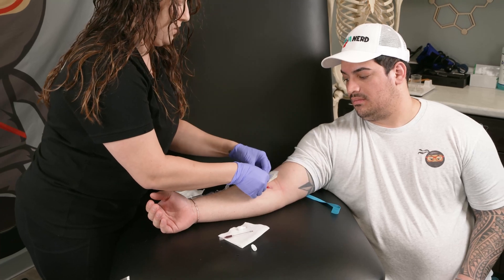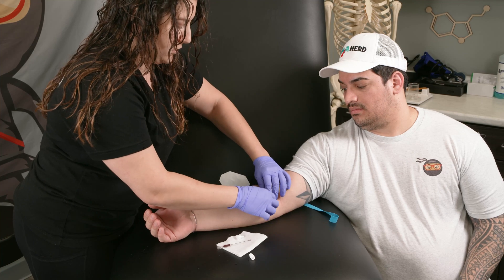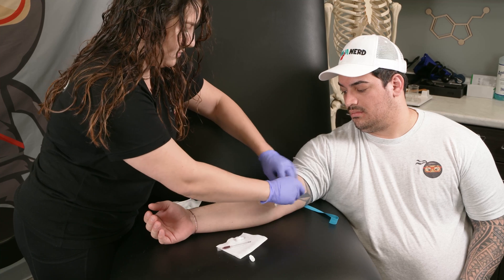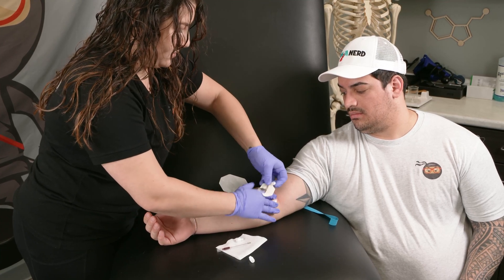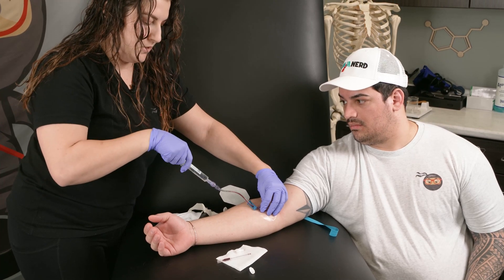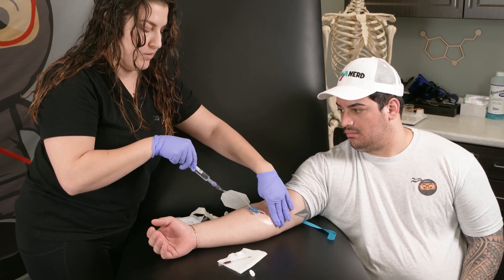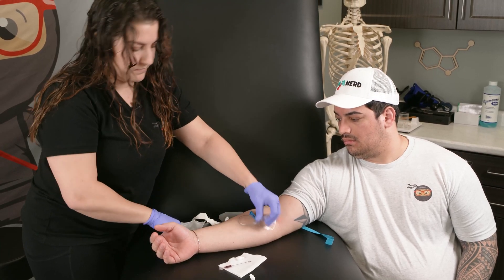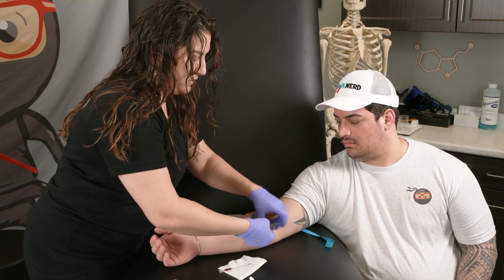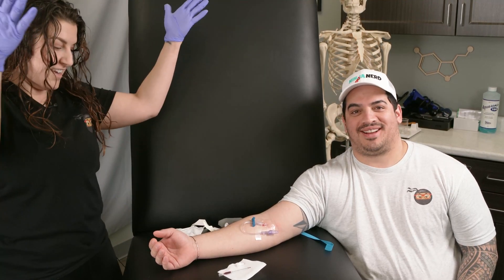Then that little piece of gauze I just clean away, and I can put my tegaderm on. I'm not letting go of the cannula because I don't want to be moving the IV around too much. I can secure it and pull off the backing. Once I do that, I know the IV is secure. I like to check one more time — any pressure or pain? I'm looking for a wheal, looking for any pain. I know I'm in the vein because I saw that blood return. Then I take a little bit of tape and secure it so it looks all nice and neat.